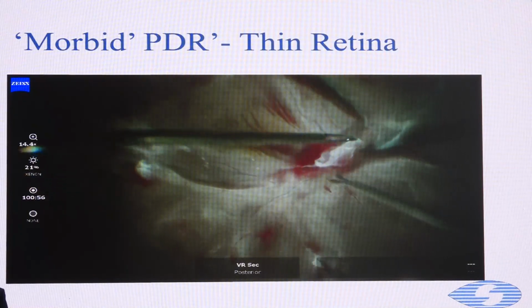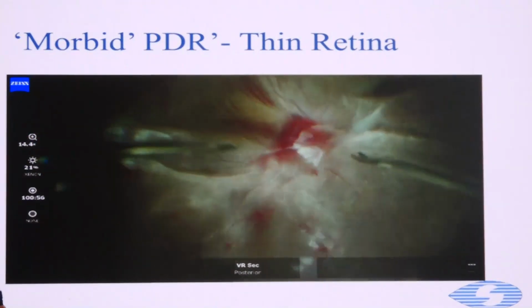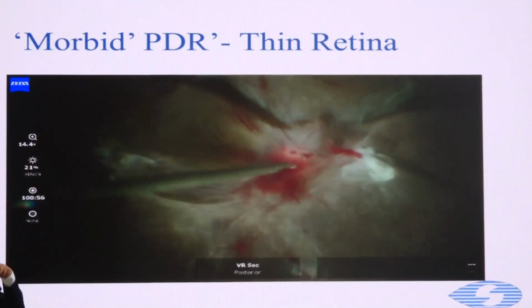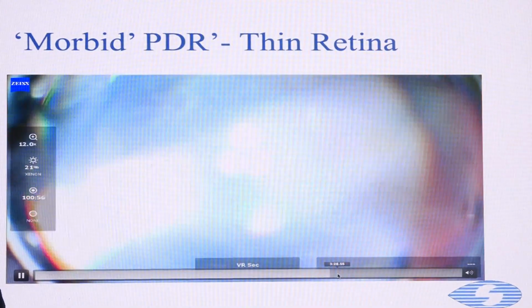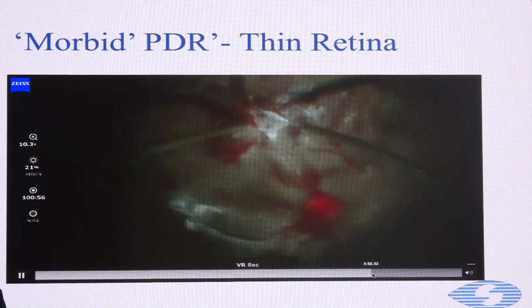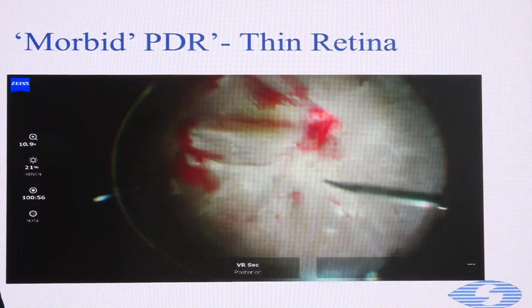So this is one step where I feel, and this could be a part of the discussion, is where you see these very, very tight connections around the disc. At least what I personally feel is that, if you see all those dissections around the disc, I don't know how it would behave if I had just pulled them the unimanual way en bloc. I think that is something that we need to learn from Dr. Sangeet, and it would take us to a very good dissection. I would also be waiting for his comments on this, because usually we would have this kind of thing.